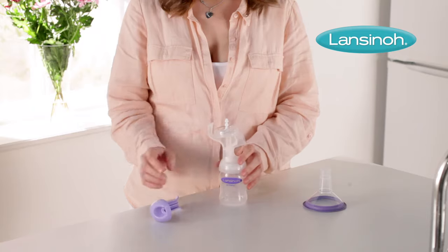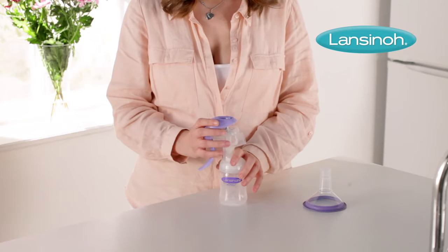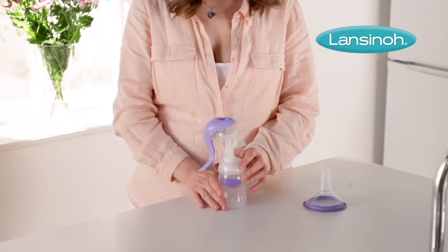Align the groove in the handle with the stem on the first notch and gently press the handle down until you hear it click for the letdown phase.